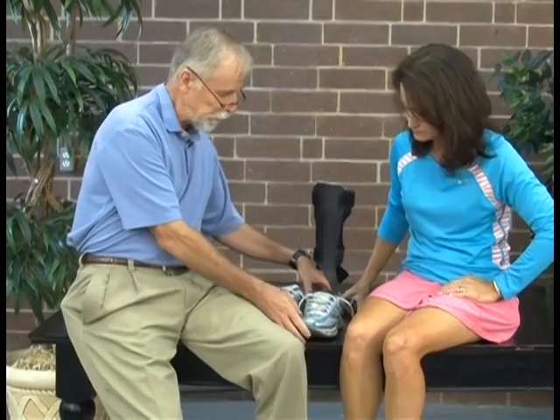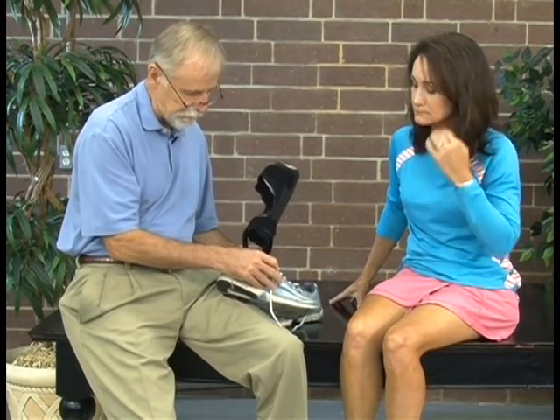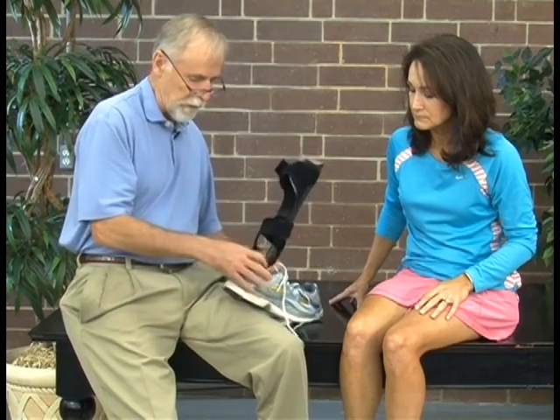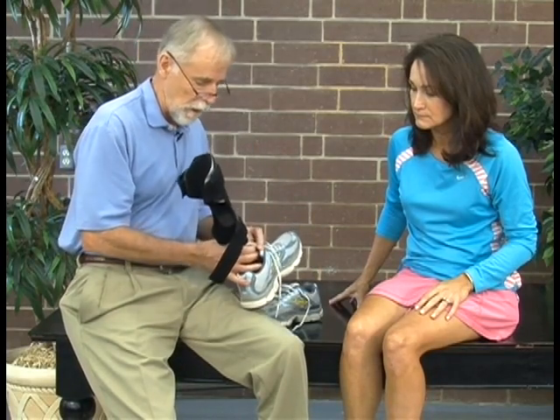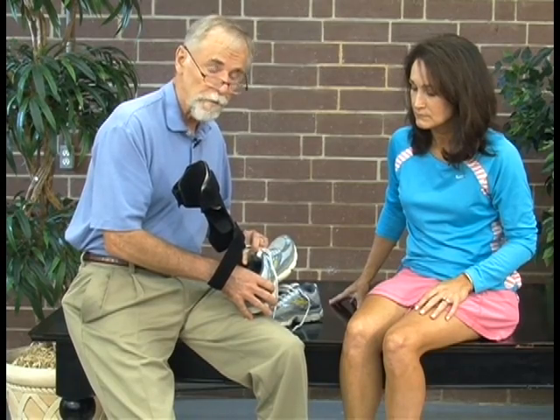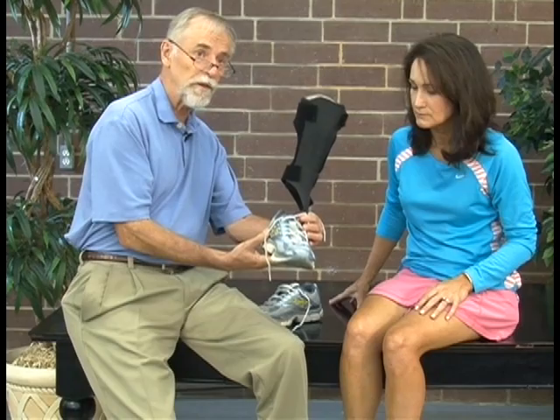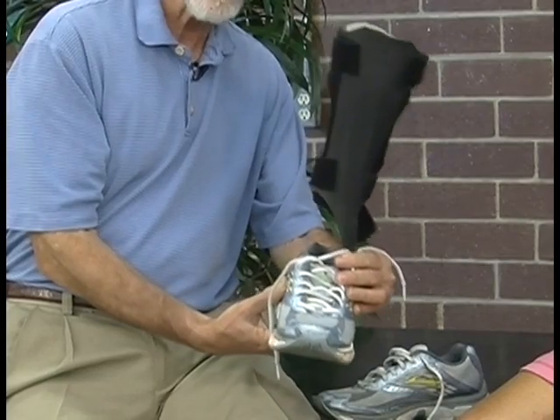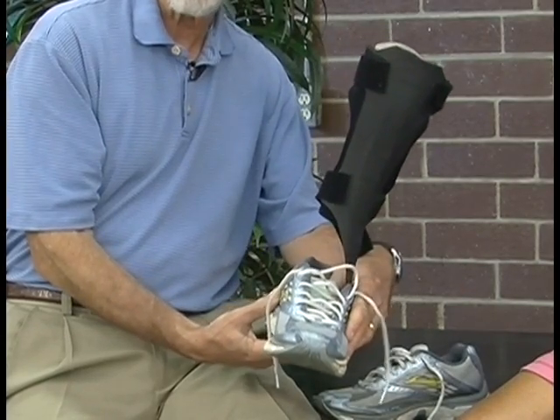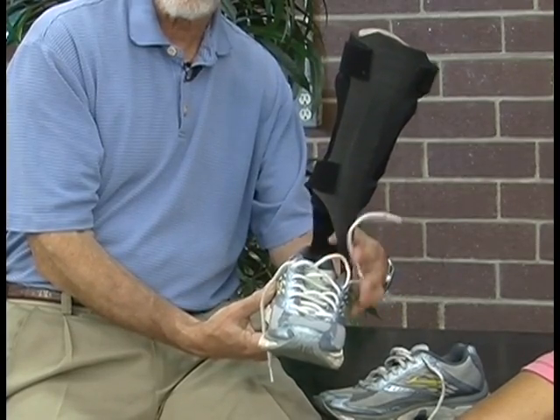Once she's put the orthotic in, you'll notice that the position of the strut — this particular shoe allows that strut not to push in on the area of the actual ankle. So the position is neutral in this shoe with the orthotic in place. If she buys new shoes, I want her taking both the orthotic and the brace with her so that she can make sure it's fitting correctly.